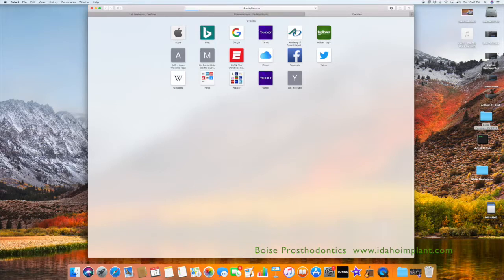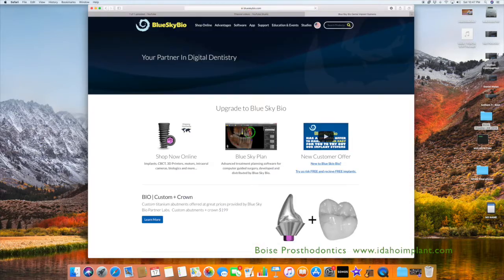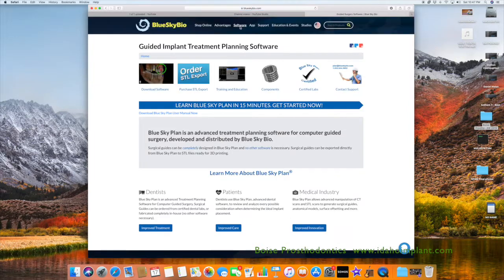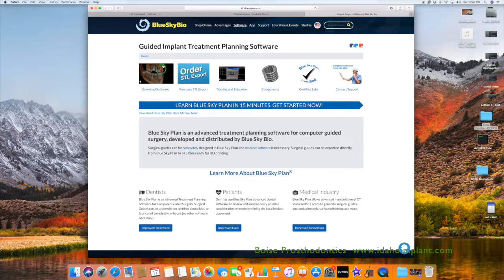Once you have typed in BlueSkyBio.com, you will go to the site, click on the Software tab at the top of the screen, then click on Download Software.